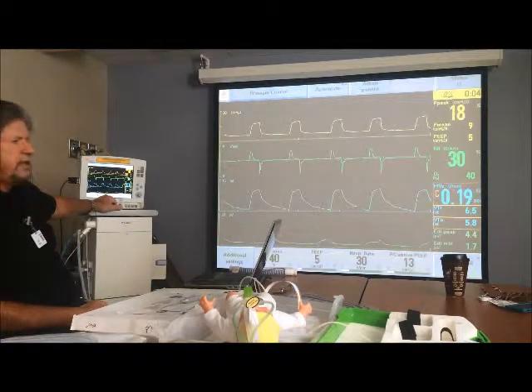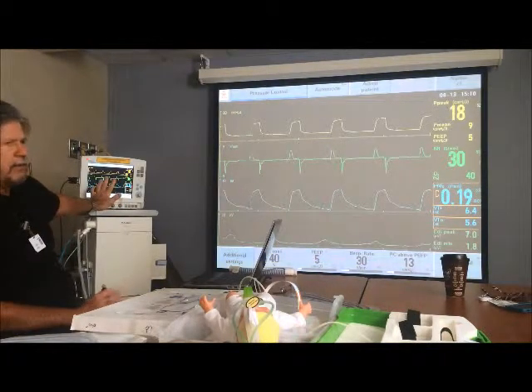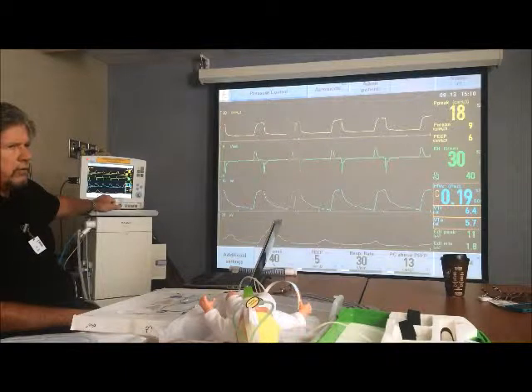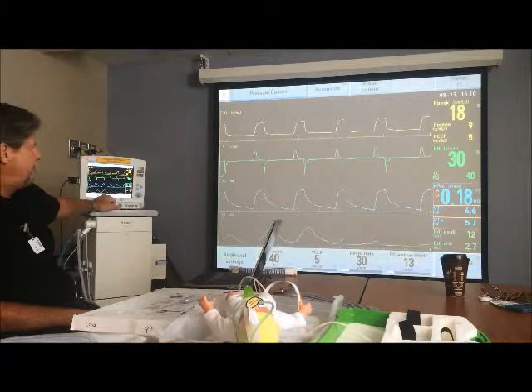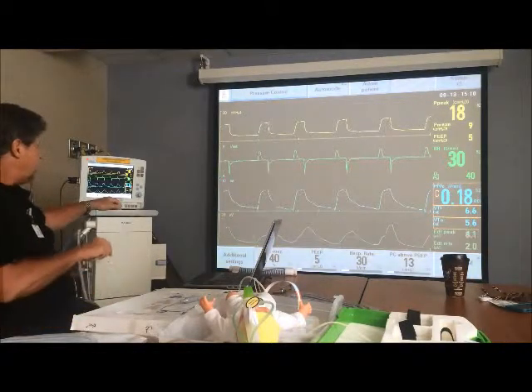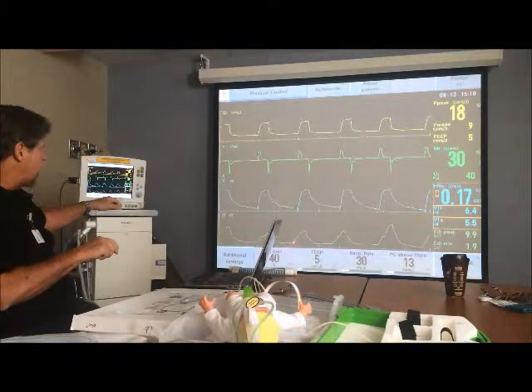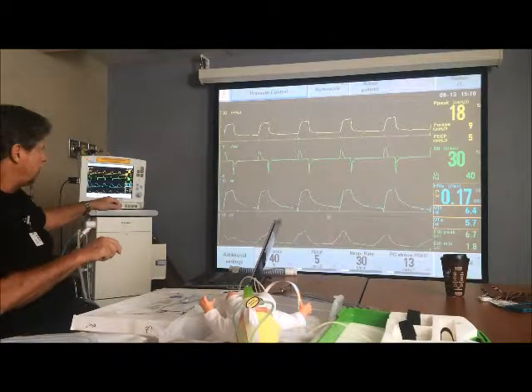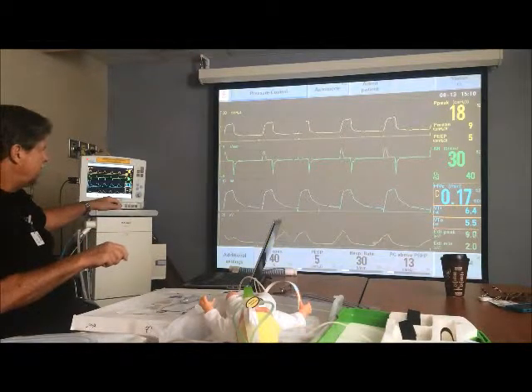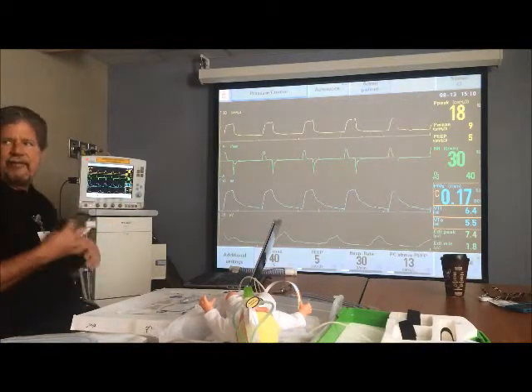if you can all see the EDI at the bottom, what does it tell you just by looking at this without knowing anything more? What do you see? We're not synchronous, right? Here, that might be synchronous, but you may go, well, look, there's the diaphragm moving there, but if your eye goes up here and here, wow, we were way off here. And in some cases, maybe the EDI moves, but the ventilator doesn't even deliver a breath. So you have a lot of asynchrony.